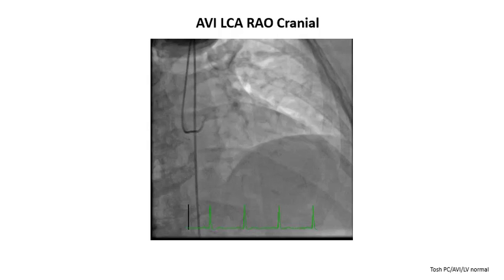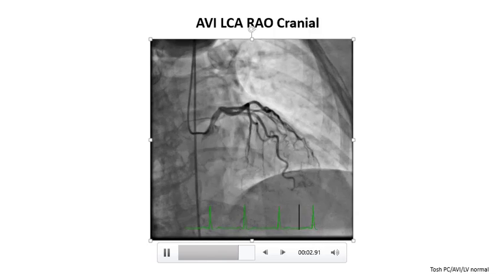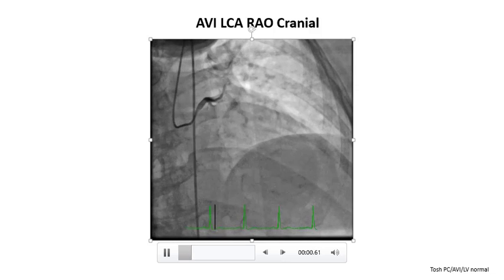This is another one now, but of a coronary artery. So you have seen the left ventricle from two views. You've seen the right heart, right from the right atrium all through to the pulmonary circulation and coming back to the left heart. We're now going to look at a coronary artery. And you can see or maybe imagine a three-dimensional structure in there.